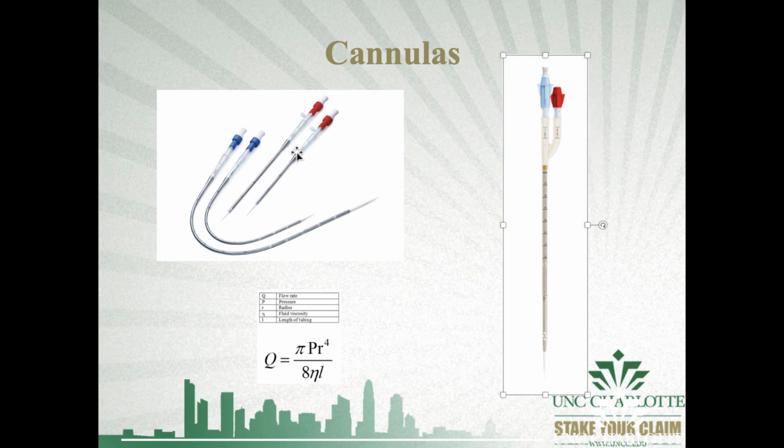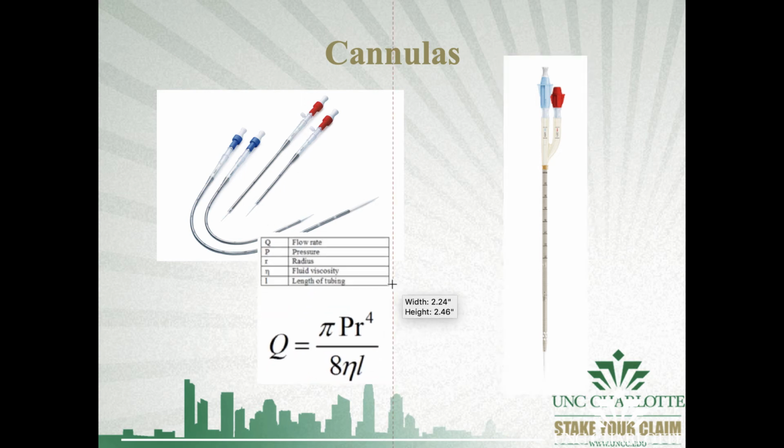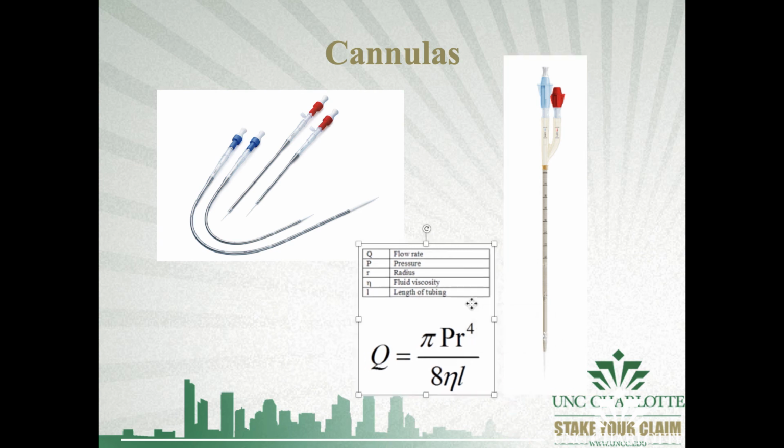So here is our general configuration, right? Here are our venous cannulas, and here are arterial cannulas. And all I want you to note here is the difference between the two. Here you see that our venous cannulas are longer. You can't see the different holes. You kind of can, but there are different holes on arterial versus venous cannulas, and that's due to their actual mechanism of functioning. And our arterial cannulas are shorter, right? Because we want a shorter return device for less resistance.